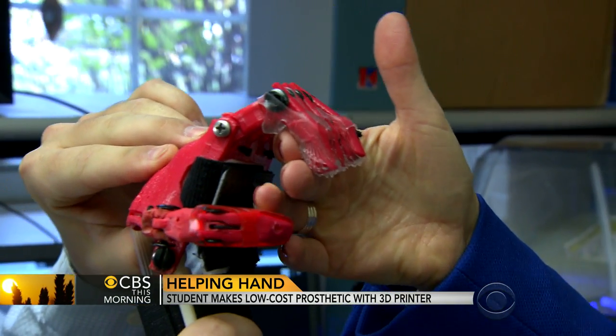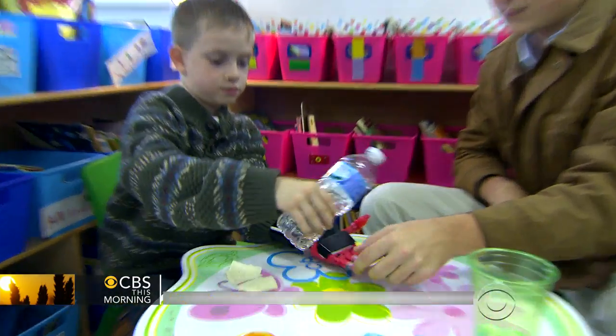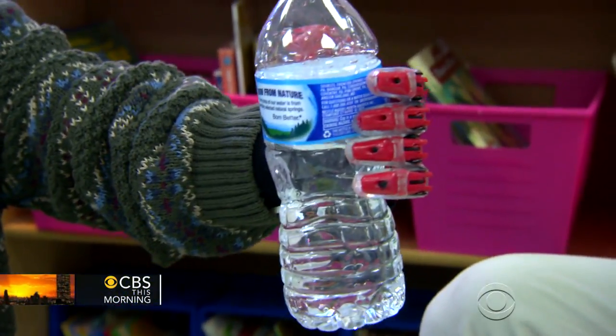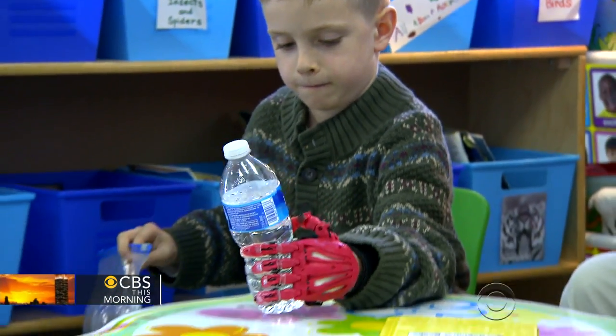Do they have grip strength? They actually do have grip strength. His goal is for Holden to be able to do things the rest of us take for granted — to be able to eat dinner while holding a knife and a fork at the same time, to grab onto his scooter or his bike with two hands, maybe even swing a baseball bat if we get it strong enough.